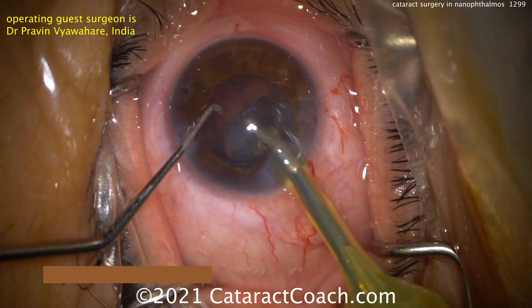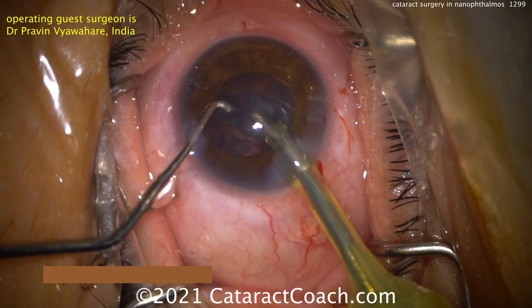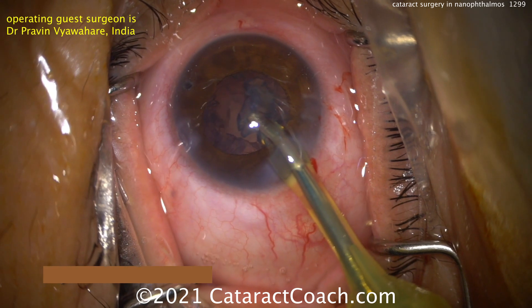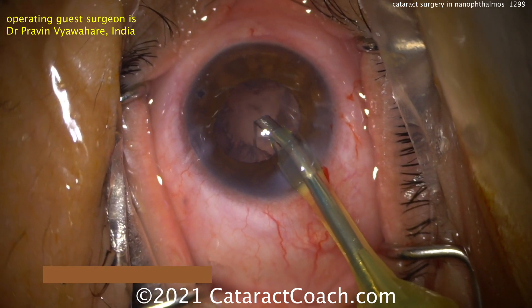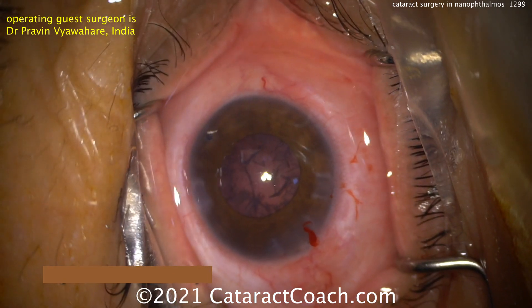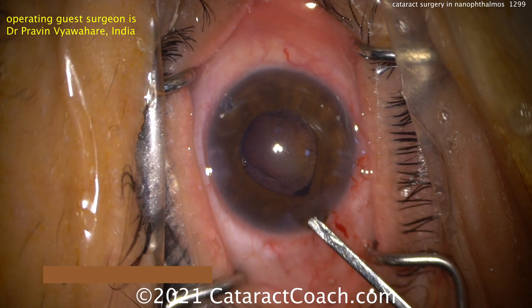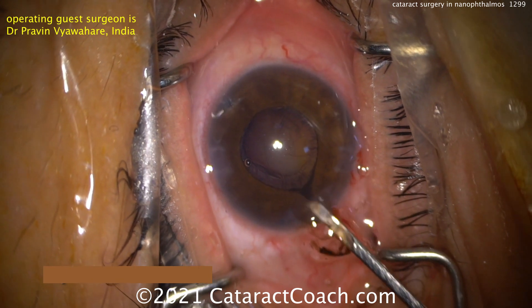There's no appropriate sulcus here — the sulcus is very small, so you don't want to break that bag. You want the IOL to go right in the capsular bag, so be very cautious and take your time. Some surgeons like to make a little window to prevent choroidal effusion — you don't necessarily have to do that, but again, this is a high-risk case. Now you can see the nucleus is out; being very cautious here with that iris.